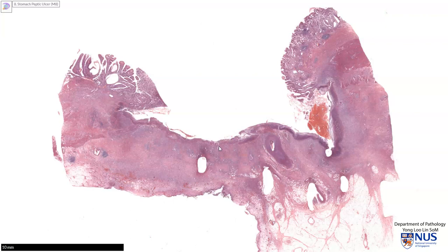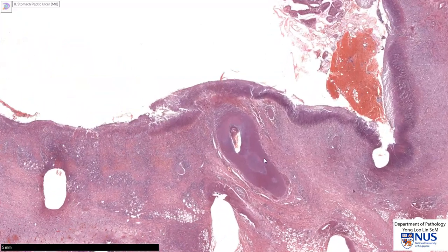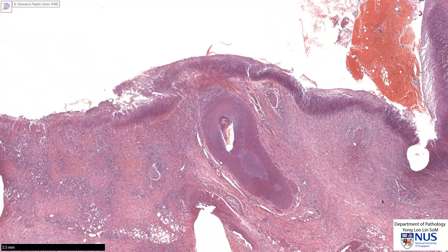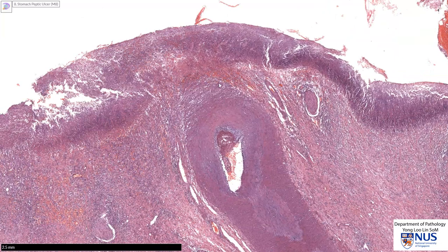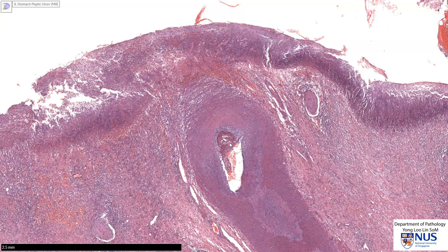At the base of the ulcer, let me point out a structure here — an elongated structure with a central lumen. This is a sizable blood vessel, and you can see that it is actually quite close to the base of the ulcer. If this ulcer were to erode into this blood vessel, there may be catastrophic bleeding. The patient will have severe hypotension or hemorrhagic shock, and this can actually lead to death from exsanguination.